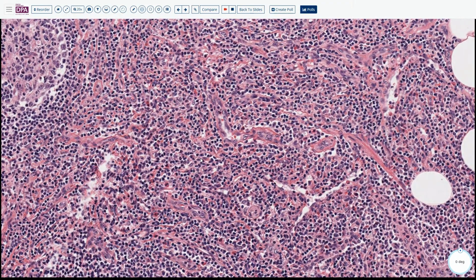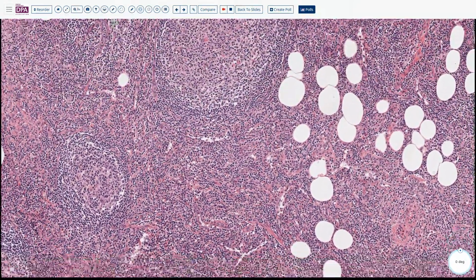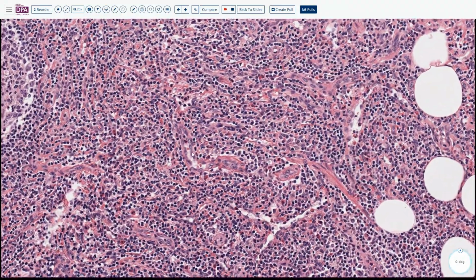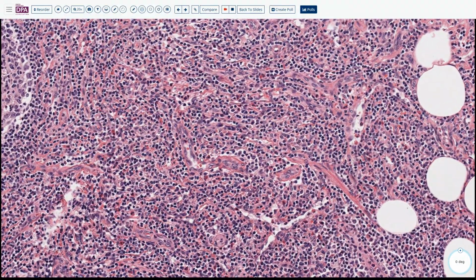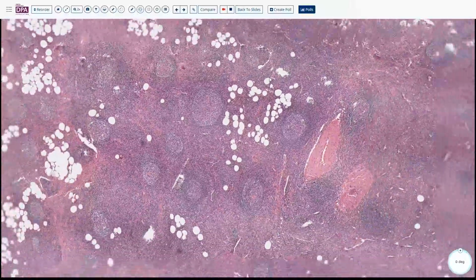So because we have a counterpart in the skin, when you see the skin finding without this germinal center, but other things are the same. We have eosinophil, vascular proliferation, and then we have this plump endothelial cell, that is the ALHE, angiolymphoid hyperplasia with eosinophilia. So this is the counterpart in the skin. They show exactly the same pattern, but just without the germinal center. So this is Kimura disease.